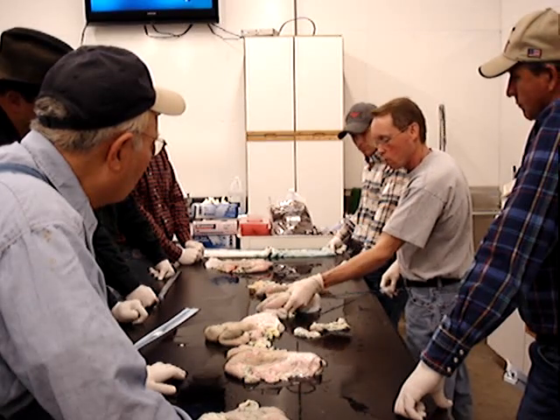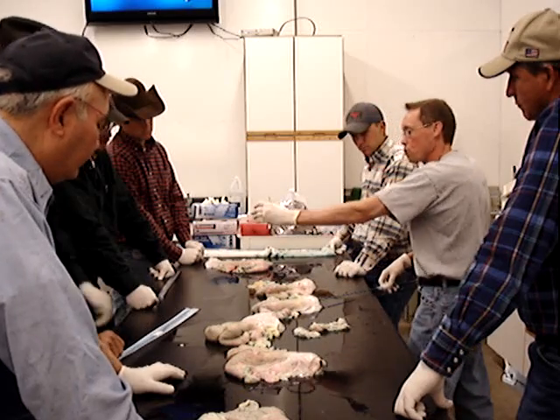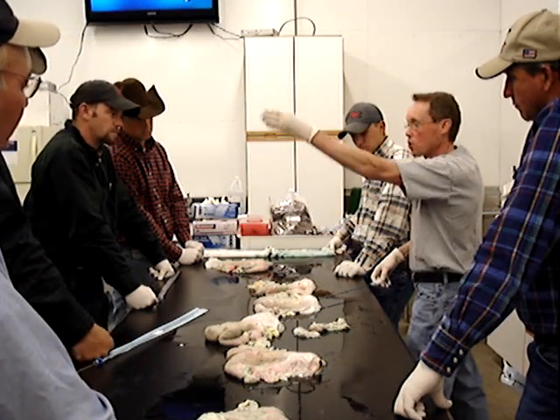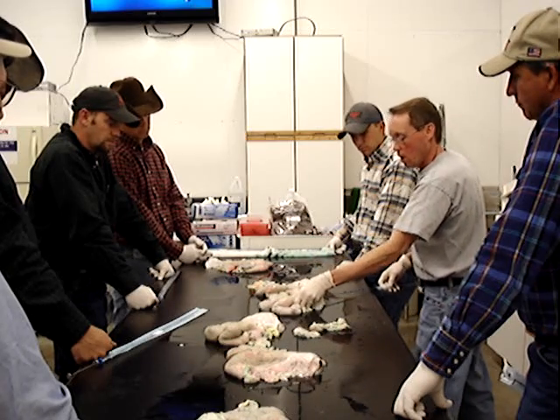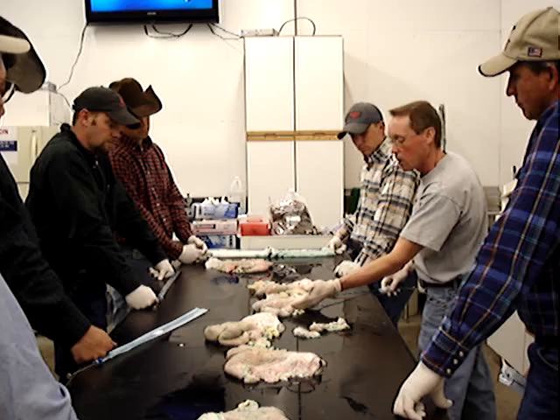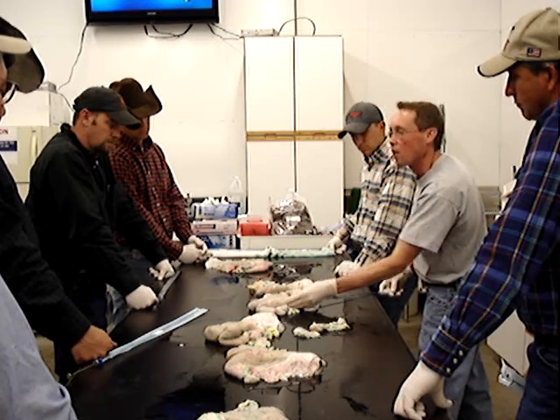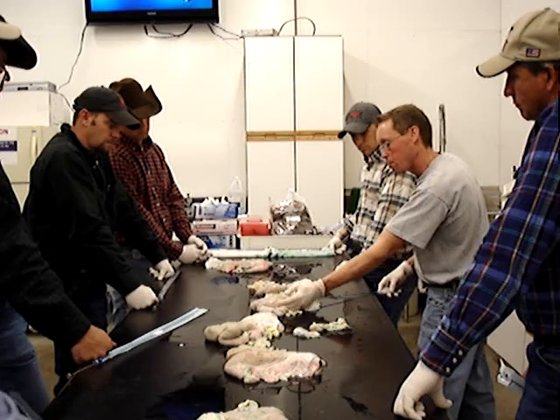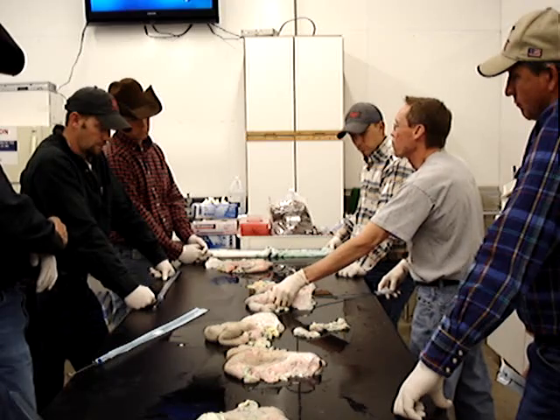A couple of choices. Push around the horn like this. Usually what I'll do — I'll go down like this on top of it, kind of push the tract over. So the left horn is down the center line of the cow. Push it over. So the moment as you enter the body, I'm kind of pushing this way. The side of the rod is against the left inner wall in there. Kind of push it over — it's like no way are you going right this time. Push everything over. You've got to go left.